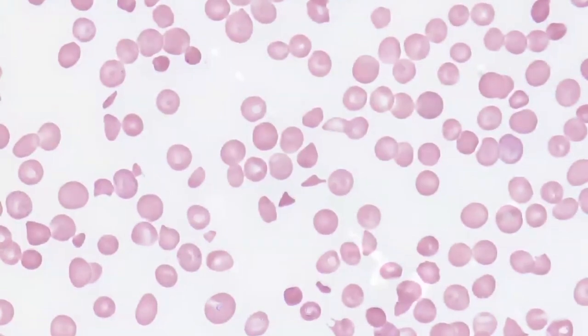Red cells show fragmentation when they're damaged by any of the following factors: fibrin strands blocking the lumen of microvasculature, shear force injury due to high blood pressure, mechanical pressure such as crush injuries, the surface of implanted prosthetic valves, heat, oxidant stress, and certain intrinsic red cell defects can all cause red cell fragments.